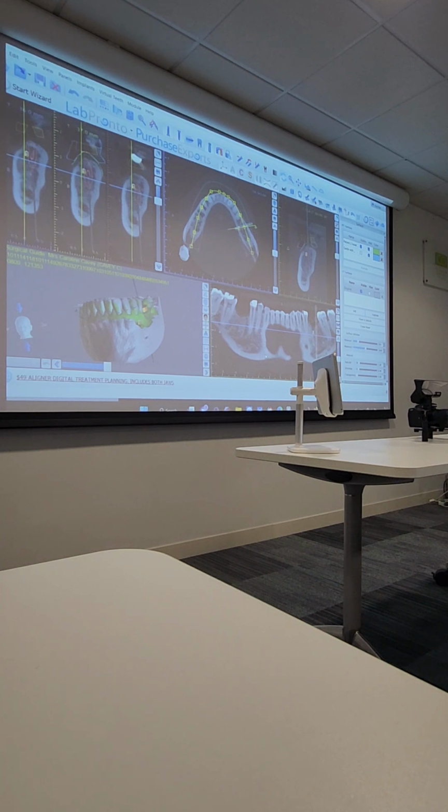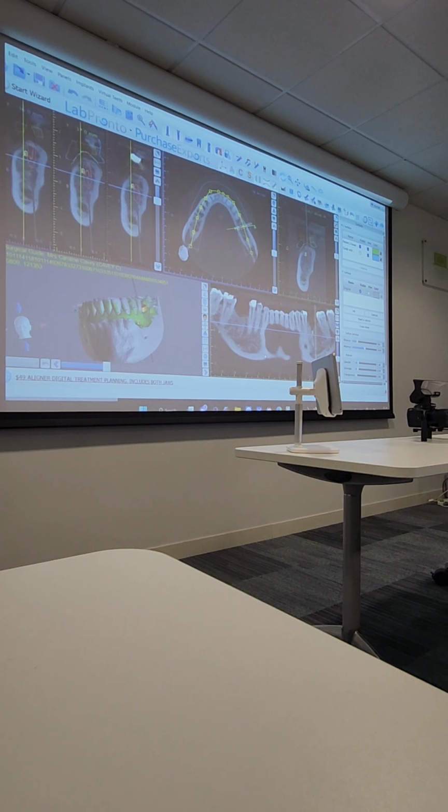So I was at home the other night and I downloaded it. When I looked at a YouTube video, the alignments, I don't know if it was an older version. Older version probably. Put spheres on teeth on the CT and your model. It was ages ago, when I started, that's how we used to do it. It was time consuming. But that's what I'm saying to you guys.